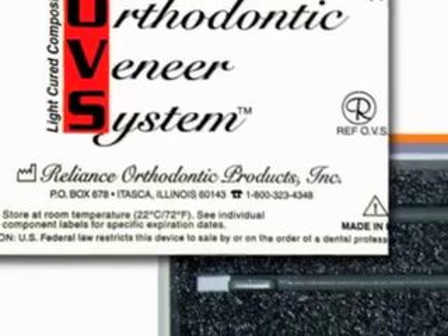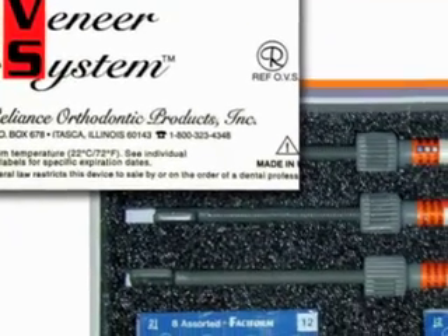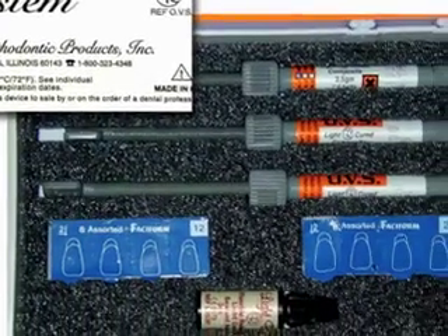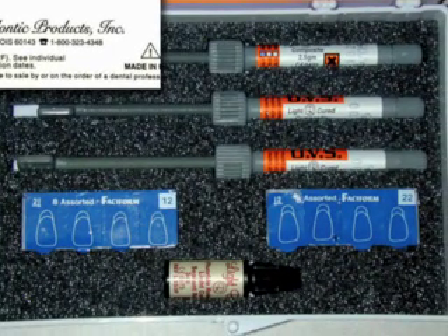The veneering kit itself is loaded with virtually all the products needed to create some great-looking veneers. These include three color match composites, sealants, four different sizes of face-o-forms, and the sticky wands to hold the face-o-forms during fitting and placement.